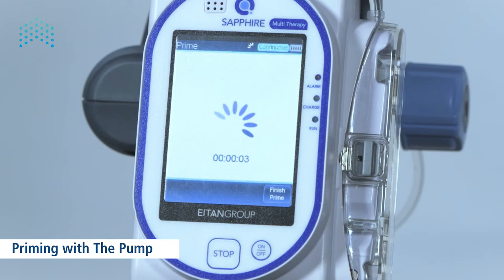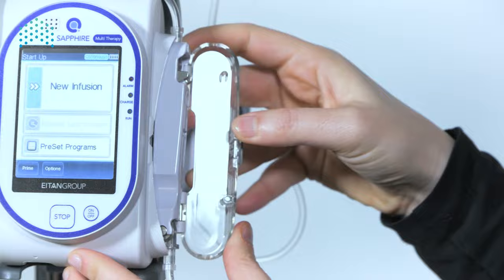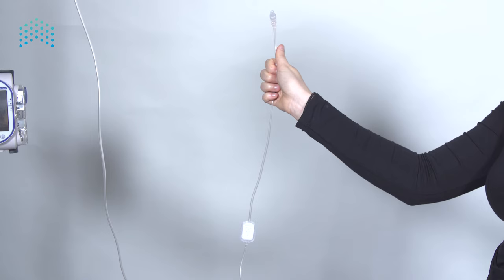Ensure the set is disconnected from the patient and press prime on the confirmation message screen. The pump prime process can be stopped if all the air is removed by pressing finish prime on the toolbar. At the end of the process, ensure all air was discarded and press OK; otherwise press prime again. When removing the cassette, push the lock up and the cassette is discharged with the AFFV automatically engaged, preventing free flow.